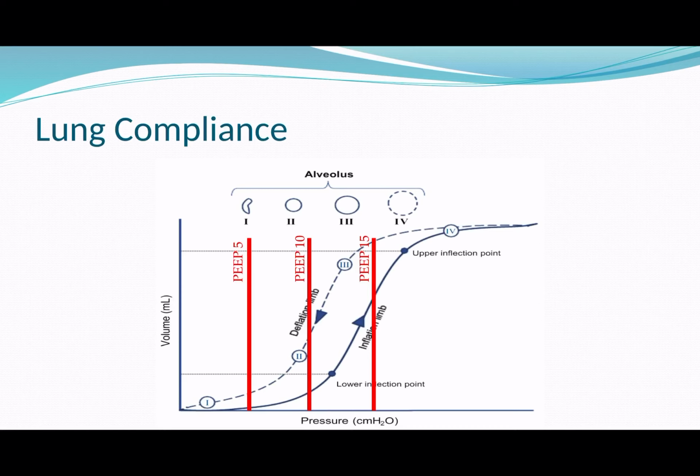It's also important to think a little bit about lung compliance. Now, when you see some of the values that we set as our PHigh or pressure high value, you may be surprised that they're quite high, 15, 20, 30 centimeters of water. And you might be thinking, gosh, how can a patient breathe on that? But this is where the concept of lung compliance comes in.